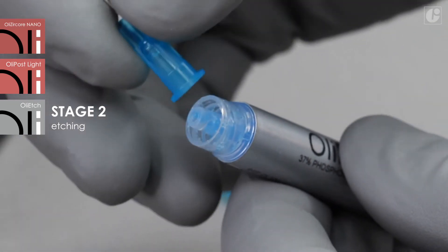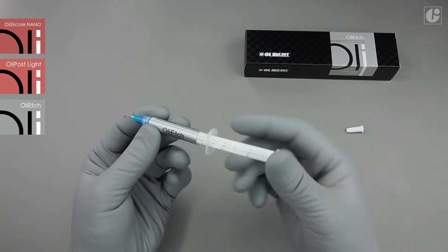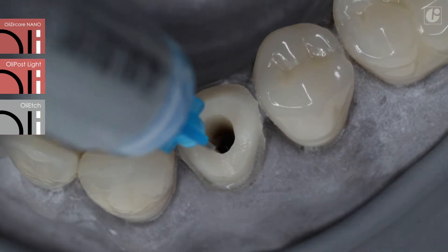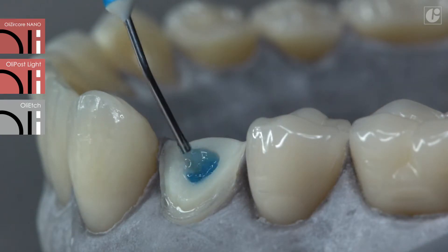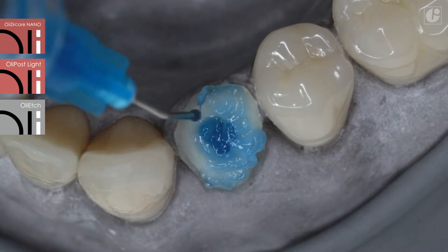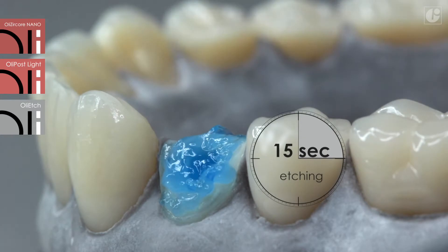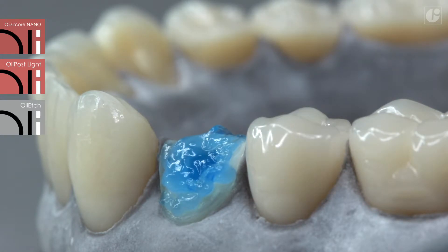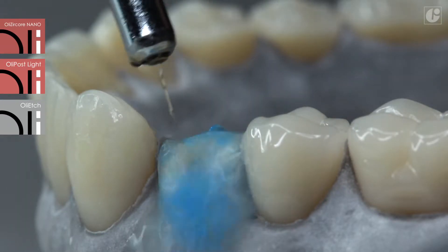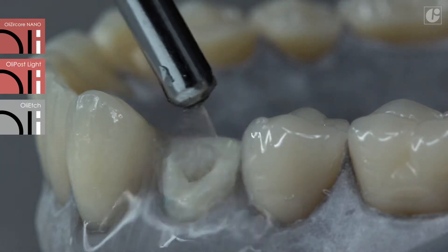In compliance with the total etch technique, the application of a bonding system should be preceded by etching of all treated surfaces with orthophosphoric acid. OliEtch has been applied in this case. Canal and dentine etching in the coronal part takes 15 seconds. Then, rinse the canal and gently air-dry the tissues. It is also recommended to use paper points in the canal. Dentine should be left slightly moist.